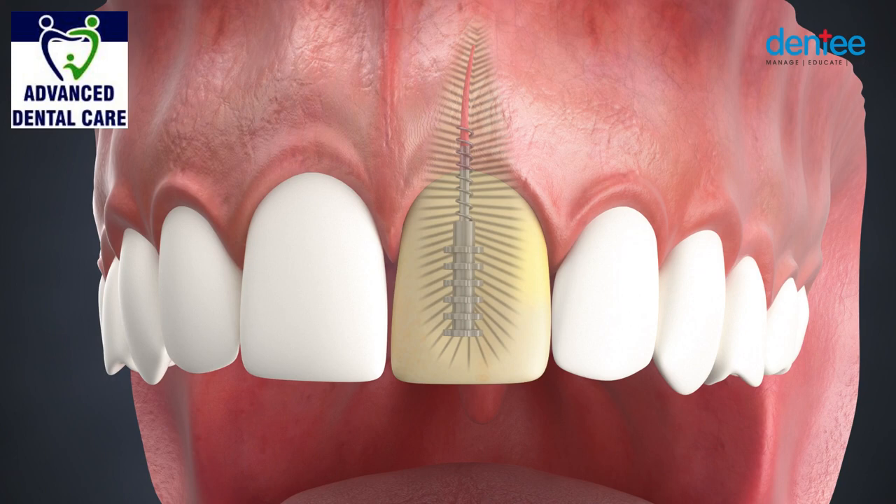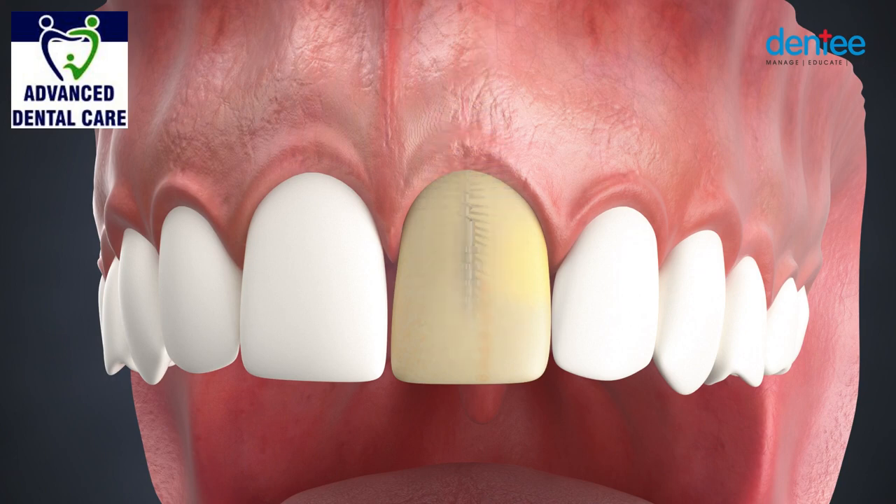Porcelain crowns are an aesthetic solution to restore a discolored, decayed, or badly broken down tooth. In this case, a root canal tooth that has been restored requires a crown.